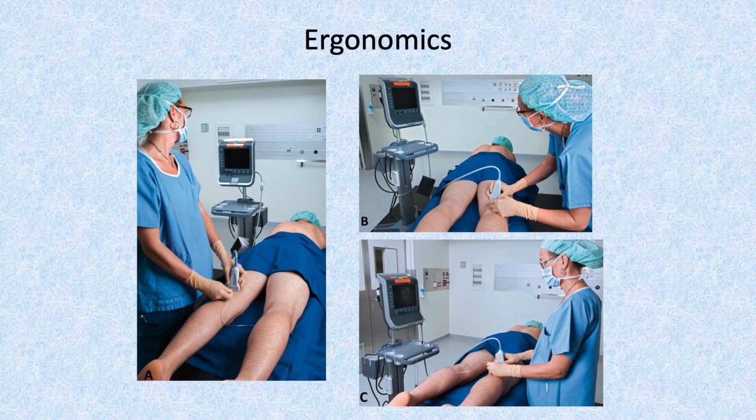Right. Then ergonomics is also very important. Example, this one. You try to make yourself comfortable. Always put your ultrasound in front of you and adjust the height so that you don't have to bend, because sometimes in a difficult block you can do it for like half an hour. Then if you tilt or turn your neck, you might get a lot of backache or neck pain afterwards.